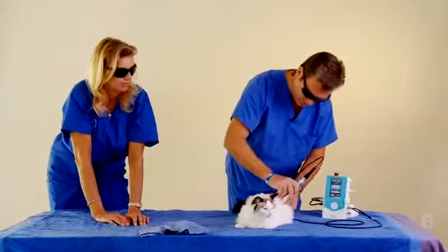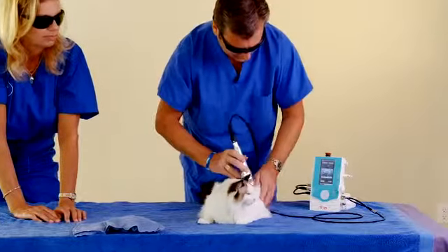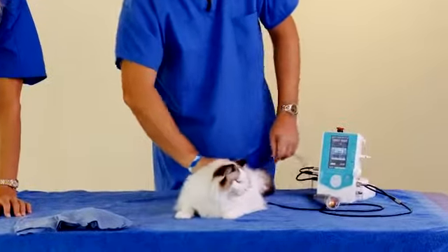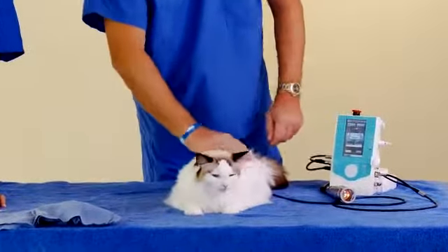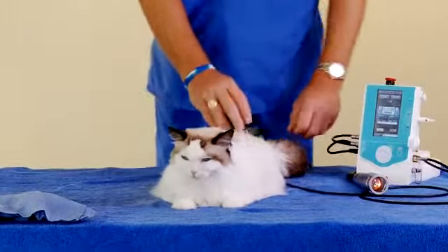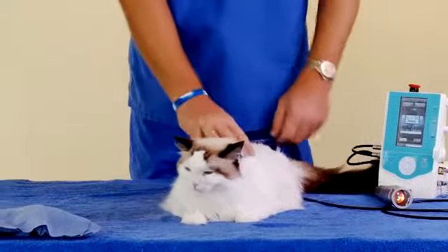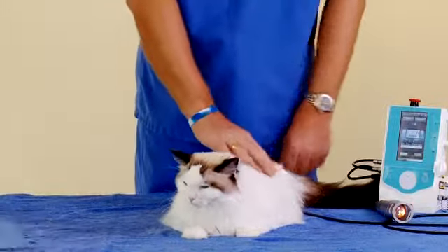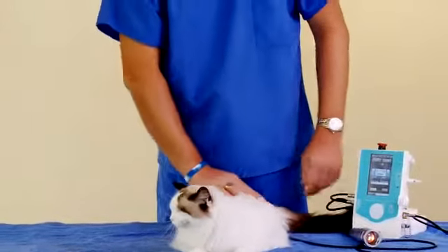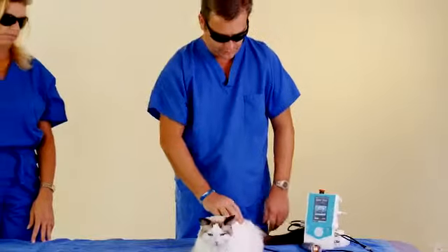And go through treatment protocols, and then turn your laser off. Give the patient some reassurance, record the joules, the treatment, the amount of the protocols, any protocols you may have changed kind of on the fly. If you think you needed to adjust something, make notes of range of motion or anything else going on with the patient that you treated with the laser.